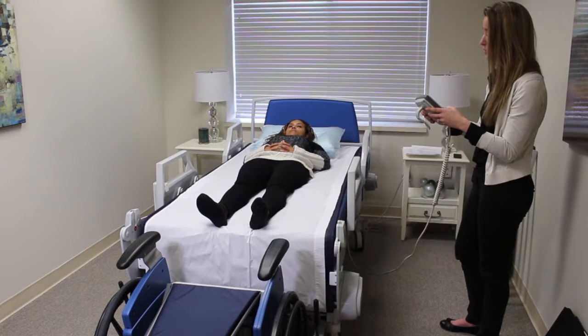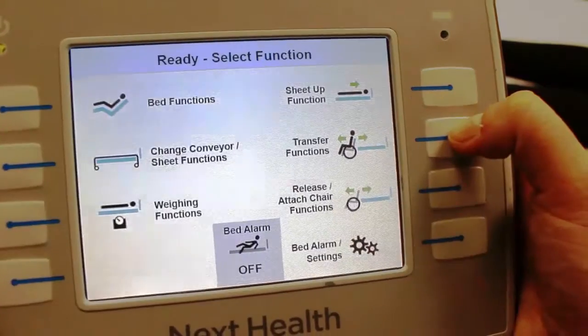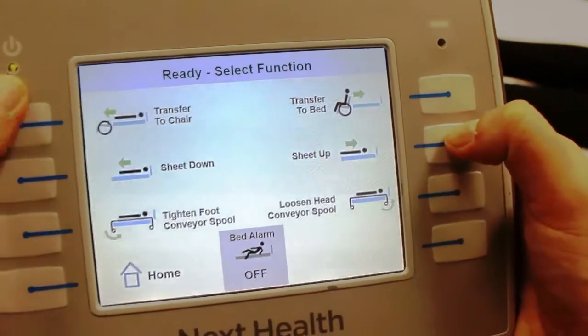Now if you want to transfer the patient into the commode chair, you go home, go to transfer functions, and transfer the chair like usual.